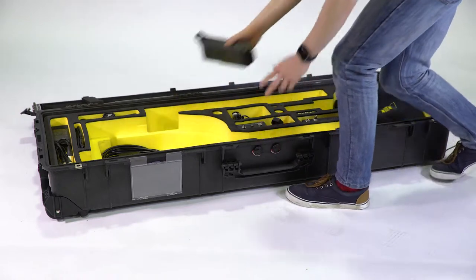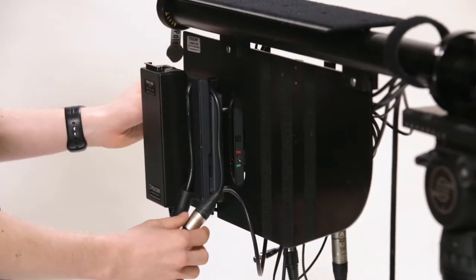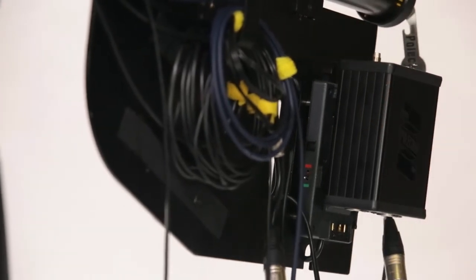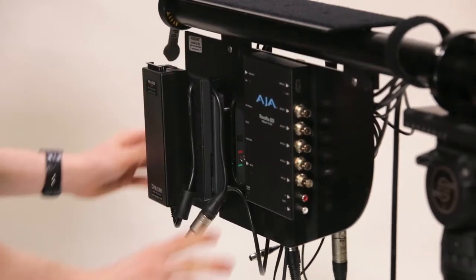You can now attach your power supply — this may be a battery or an AC supply unit depending on your configuration. Attach the RovoCam interface unit to the left side of the paddle and attach the RovoCam RX unit using velcro onto the right-hand side of the paddle.